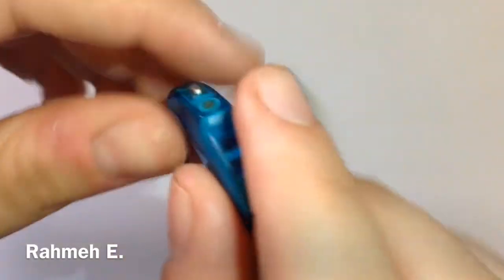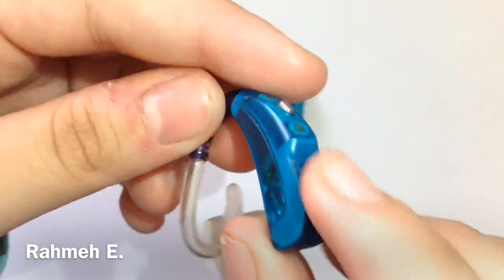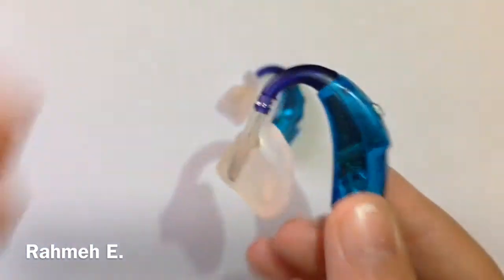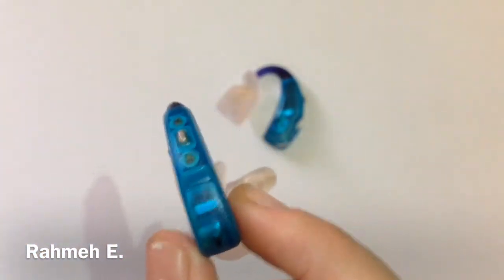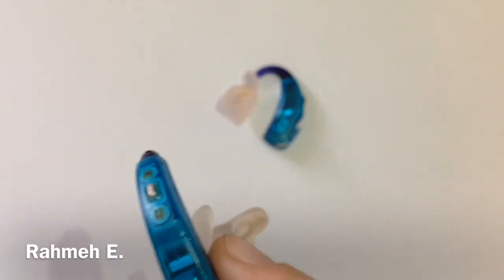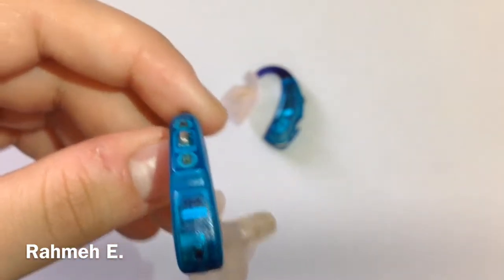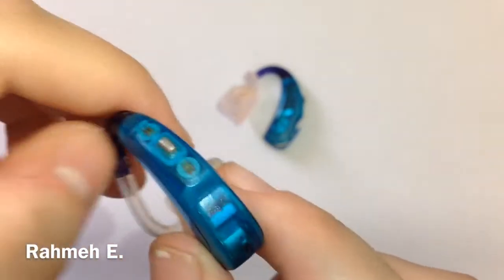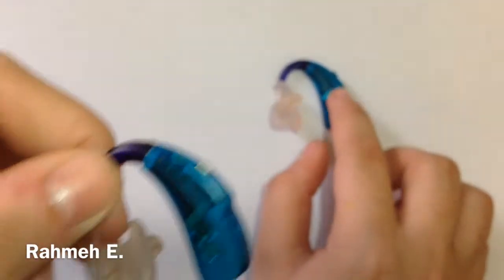Going down, you'll see this part — this is the battery door, and this hearing aid is on child lock. So you need that annoying little tool to open it. That tool always gets lost, and it's so small it's really easy to misplace. So sometimes you have to find other ways to open it.